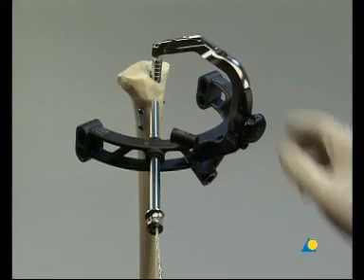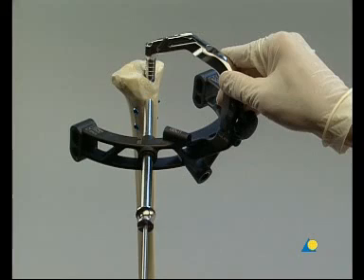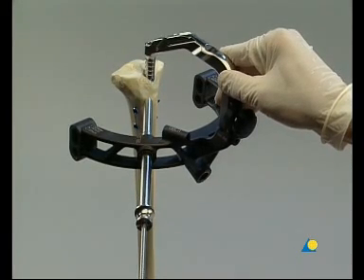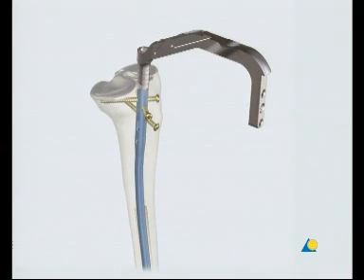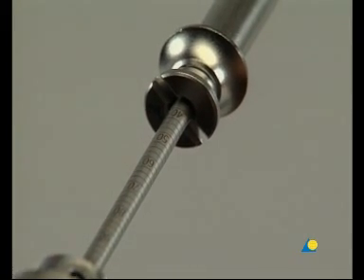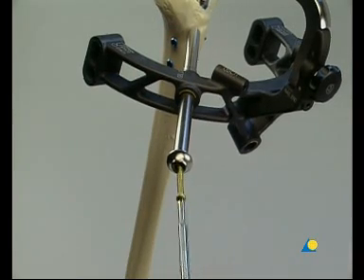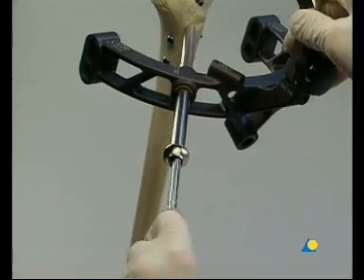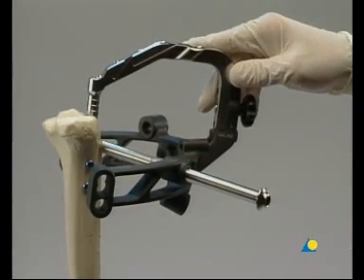The calibrated drill bit is inserted and the near cortex is drilled. Drilling continues, and the penetration of the drill bit through the cancellous bone on the tibial head is controlled with the image intensifier. The longest possible screw should be chosen. The drill bit must not perforate the far cortex, and the tibial plateau must not be damaged. The drill sleeve is pressed firmly against the near cortex, and the measurement is read from the calibrated drill bit. The measurement corresponds to the appropriate length for the cancellous bone locking screw; if in doubt, a shorter screw is selected. A cancellous bone locking screw of the appropriate length is inserted through the protection sleeve, and these steps are repeated for the other cancellous bone locking screws.